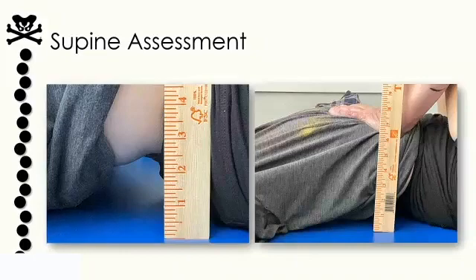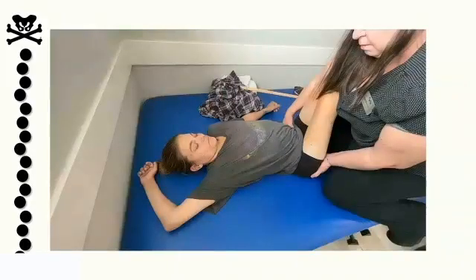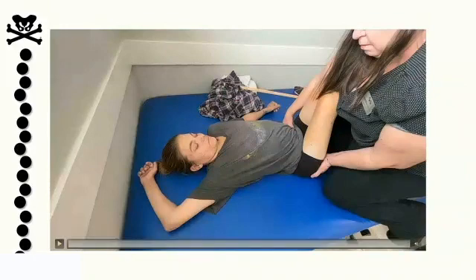Through this supine assessment, I will determine my ideal thigh to trunk angle, and where the lumbar lordosis will present once I have that position. So I'm going to check things in supine. Here's a quick little video of the assessment process.